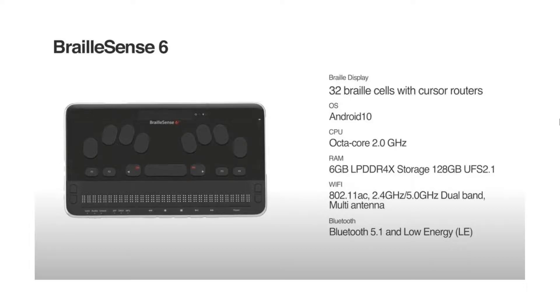Let's take a quick physical tour. For those of you who can see it, it looks very much like our previous Polaris model, and for those who can't see it, it also looks like the Polaris model, but you will feel a few differences. It is thinner and lighter — just by a smidge — at 705 grams, which is significantly lighter than our Polaris model.